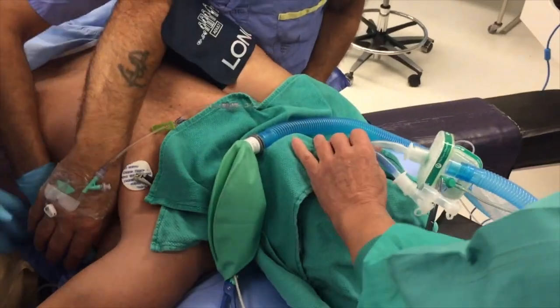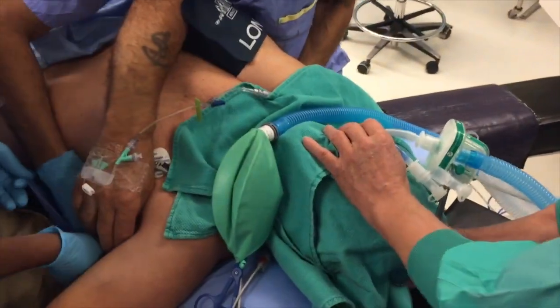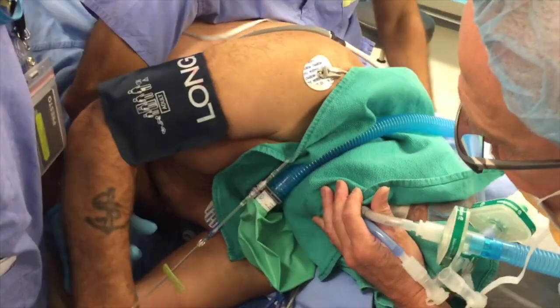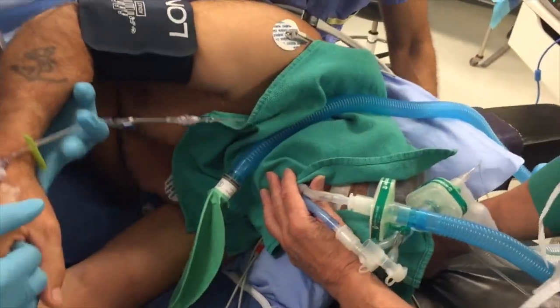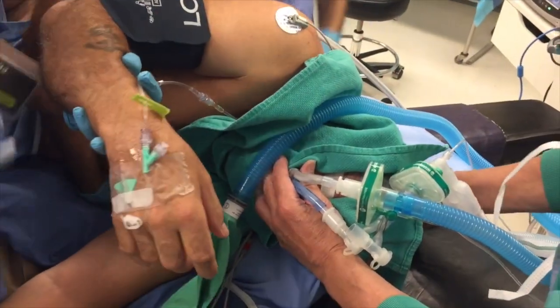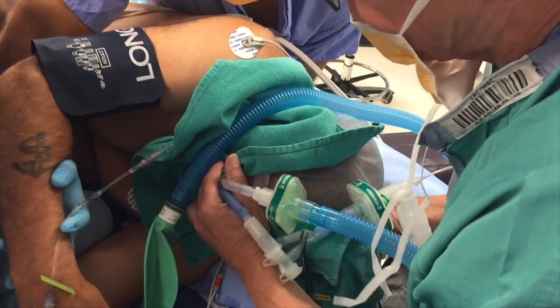All right, what do you think? Yeah. With the common technique, when positioning the patient will be on 2 lung ventilations. We don't do that. We leave the patient on 1 lung ventilation. We're not worried about low oxygen saturation. We have 100% oxygen to that lumen and can bag if we need to. While moving the patient, I'm monitoring for outward movement of the double lumen tube. Just like I showed you, I've got my hand on the tube. If I detect a leak coming from the bag, I can push it inward.